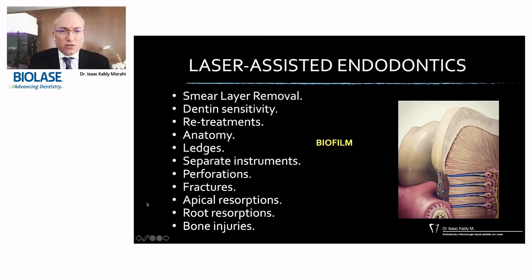Laser-assisted endodontics can also be really useful for retreatments, to address complex anatomy, to get rid of ledges sometimes, to address fractures or apical resorptions or bone injuries. But I'm going to speak tonight just about how this laser energy can be beneficial for root canal disinfection.